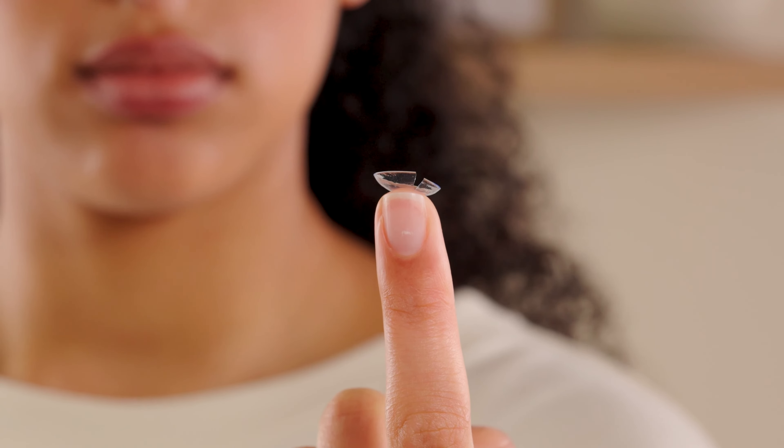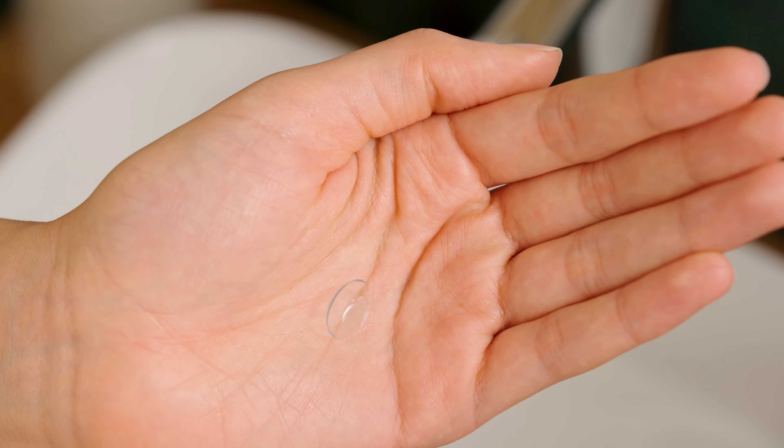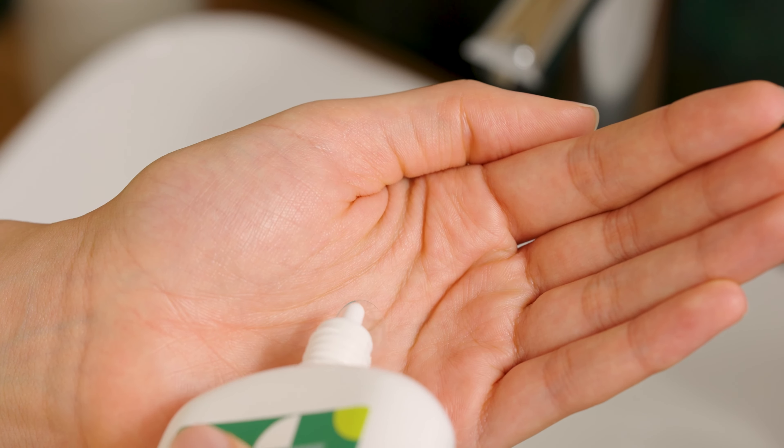But if it's still annoying you, take the lens out and have another look. It could be torn or damaged — if so, you'll need to throw it away. If not, give it another rinse with your solution.